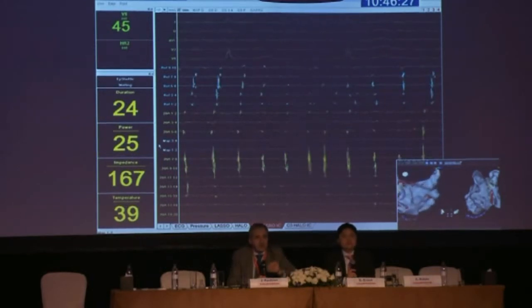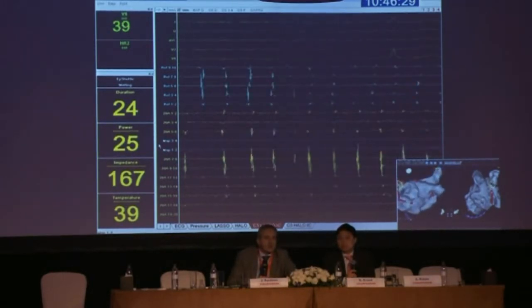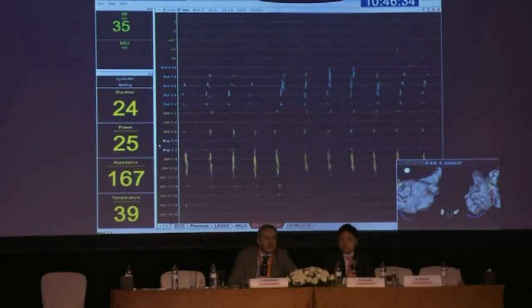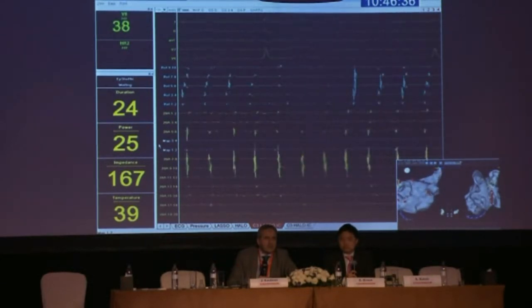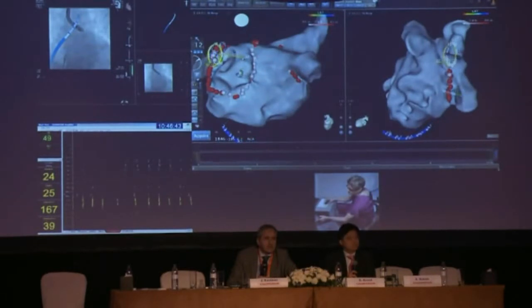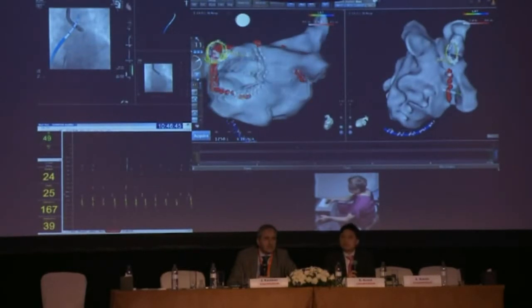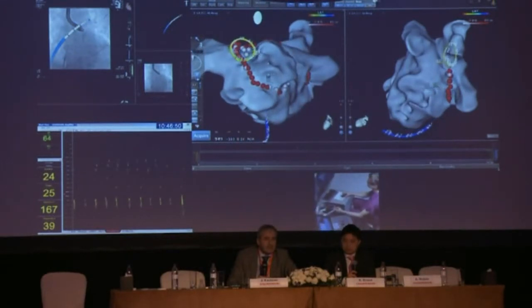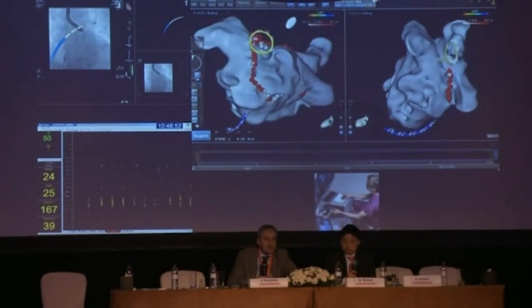Okay. I'm still concerned about the issue of the carina, or staying on the ridge if you don't have the Smart Touch. Not having a fluoro or not having an ICE, would you still be comfortable that you're 100% on the carina, not falling into the appendage or not drawing back? I mean, this wouldn't give you that confidence, would it?